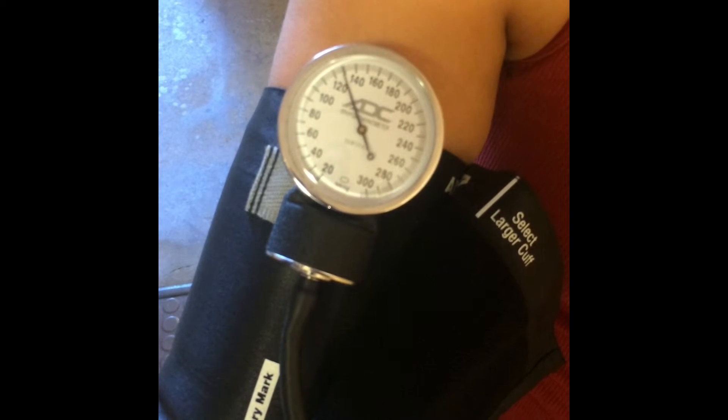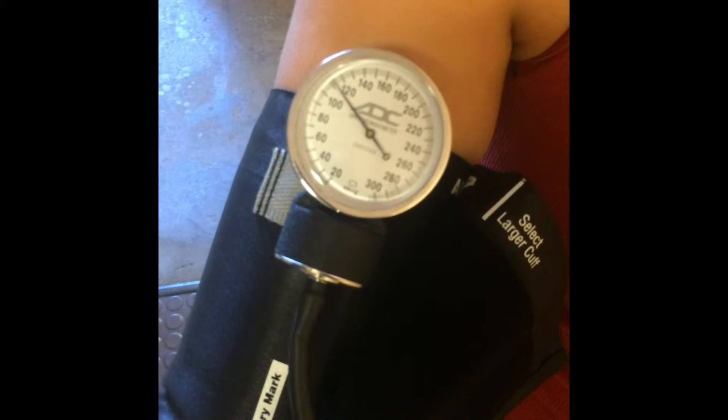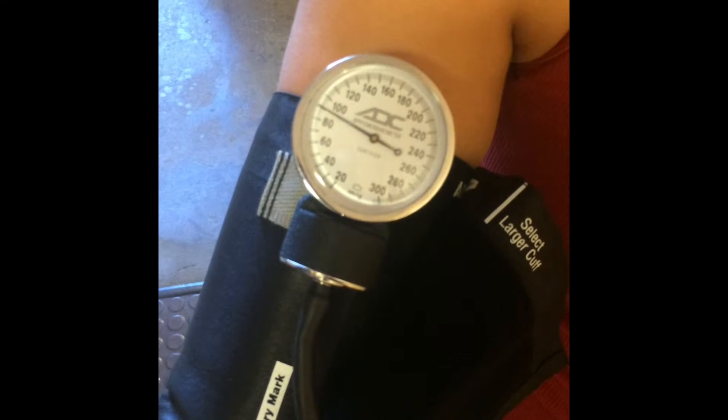You will be hearing the systolic blood pressure, which is the first of two or more Korotkoff sounds heard in phase 1. The diastolic blood pressure is the point before the disappearance of Korotkoff sounds, which is phase 5.